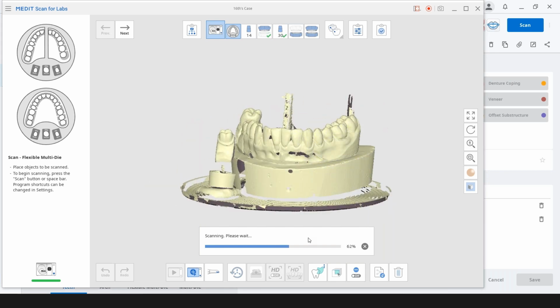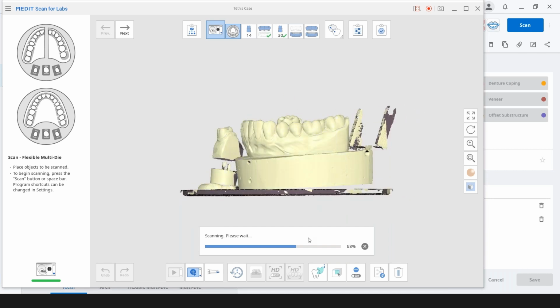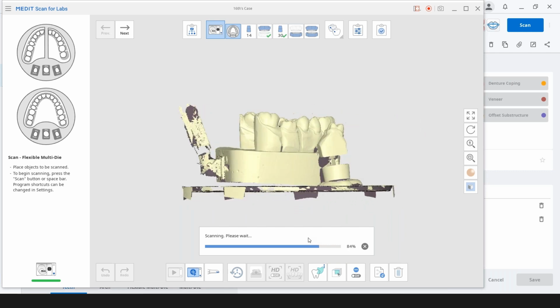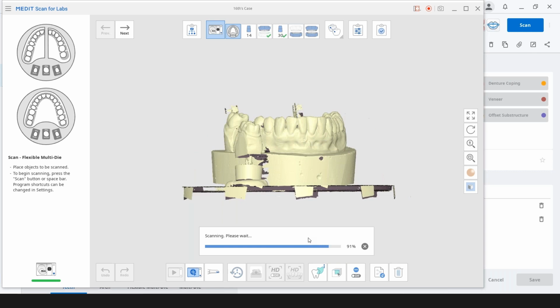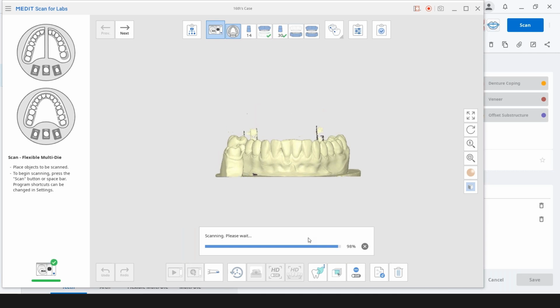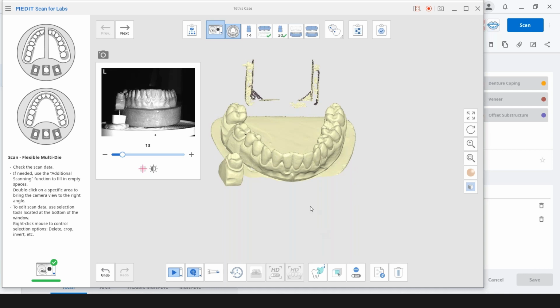Absolutely. So while that's scanning, I have another question regarding the light settings. If it's a reflective surface, is it better to go brighter or darker? For me, I would say you would address it per your site, like how the details look at that point in time. Well, your goal is to take away reflection. So if something's bright or shiny, you want to make it darker. Okay, got it. So darker might be better.